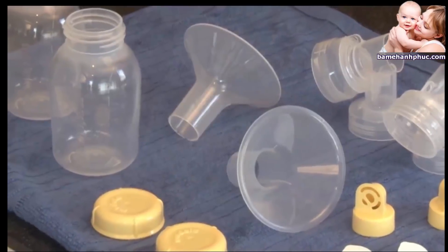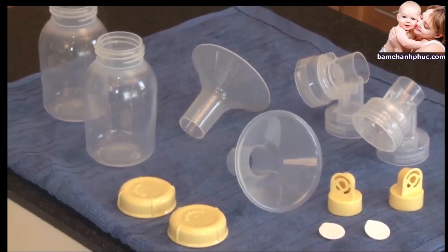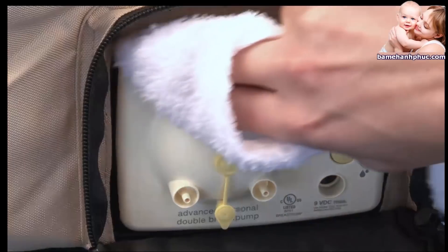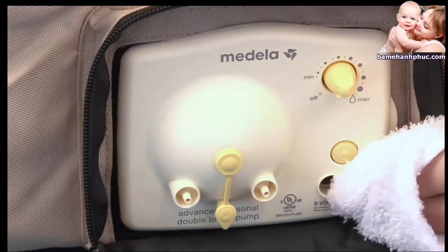Allow the parts to air dry in a clean area, and store dry parts when not in use. In addition to washing, you can boil parts or use Medela's Quick Clean Micro-Steam bags for daily breast pump kit sanitizing. Use a clean damp cloth to wipe the face plate of the breast pump after each use.